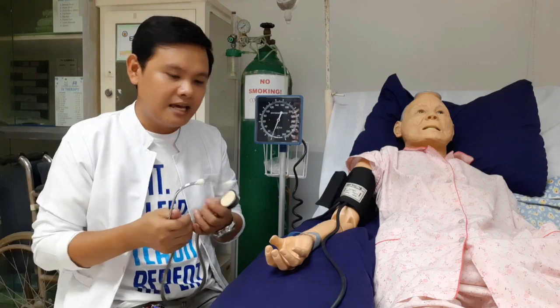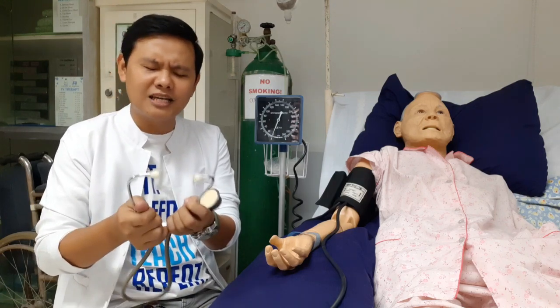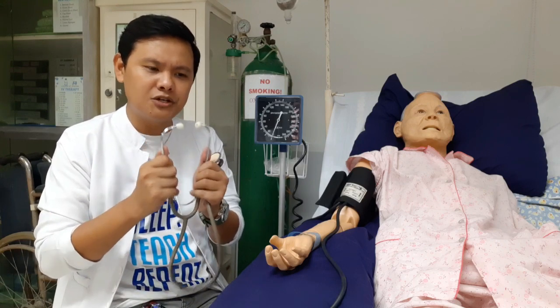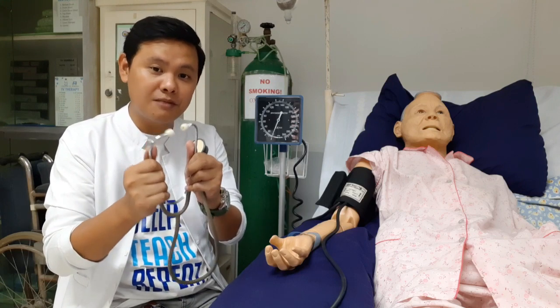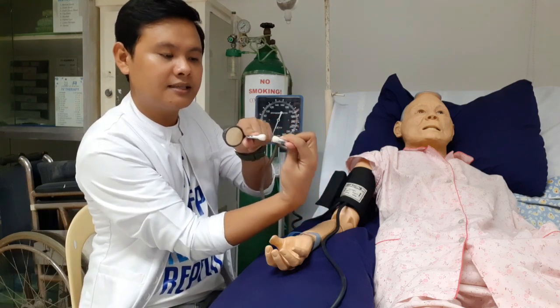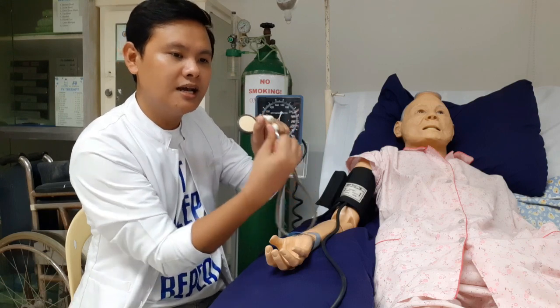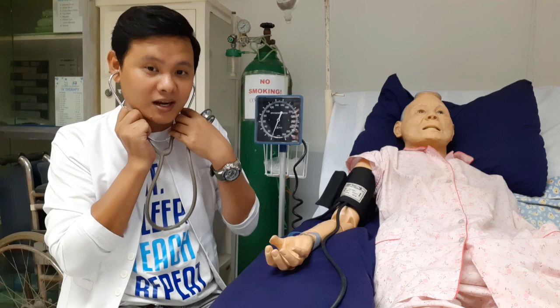Okay, next one, insert the ear attachment of the stethoscope in your ears. But prior to that, be sure that it is slightly bent forward, or tilted slightly forward. Usually you will see that stethoscopes are like this, touching each other. So what you are going to do is bend it forward, so that it will be easier to insert in your ears. It fits.